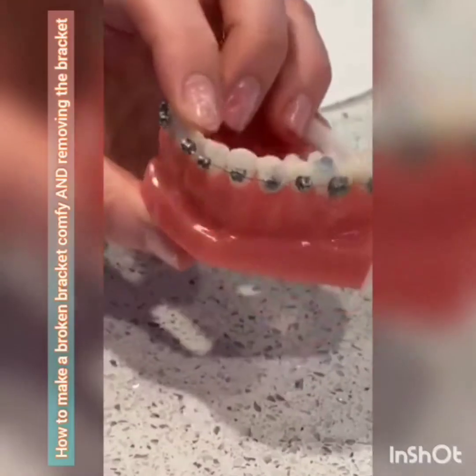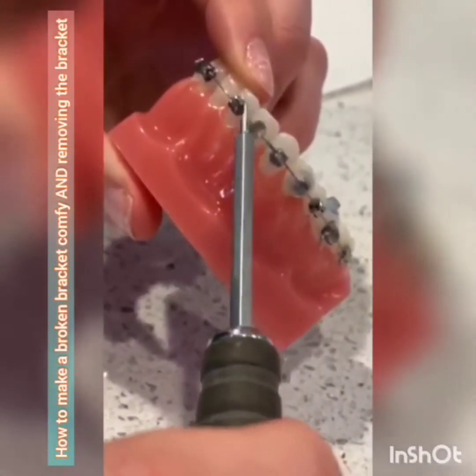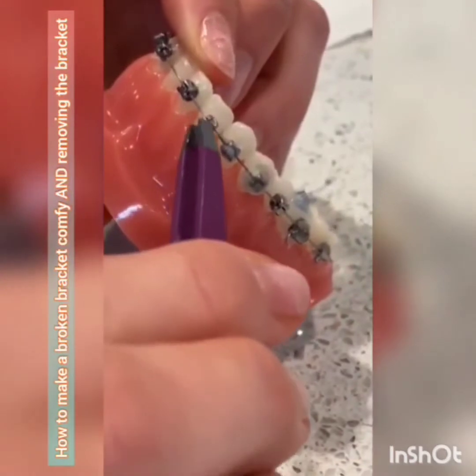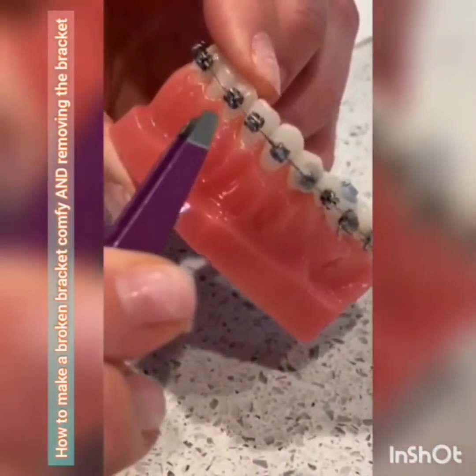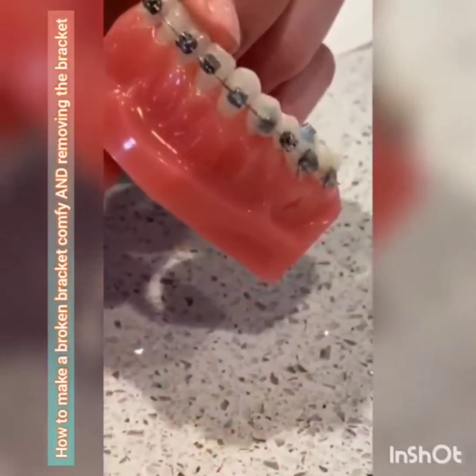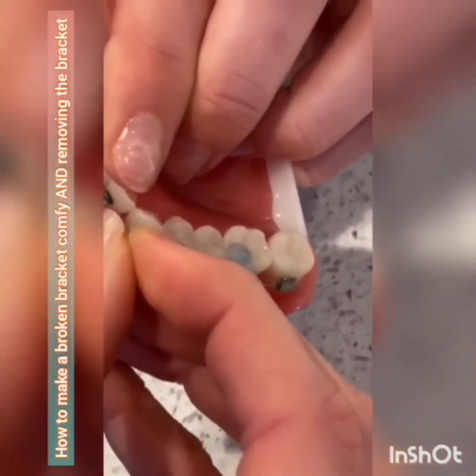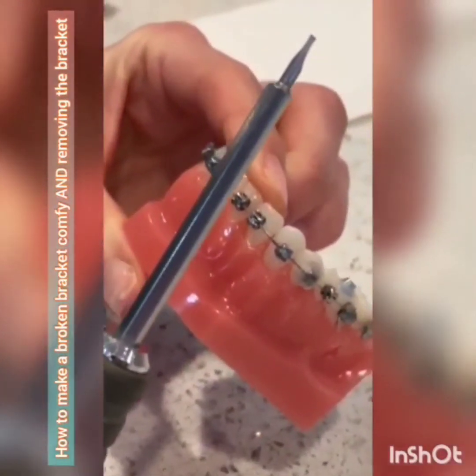Alright, so another common problem is that your bracket is loose and it actually swivels on the wire and slides back and forth. You can take a pair of tweezers just to make it comfy and flip it around so it's not bothersome to your cheek or your tongue, or you can actually use your fingers as well if it's in the front. So you twist it like that.